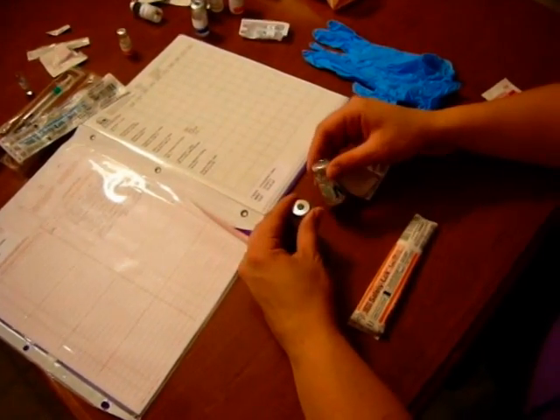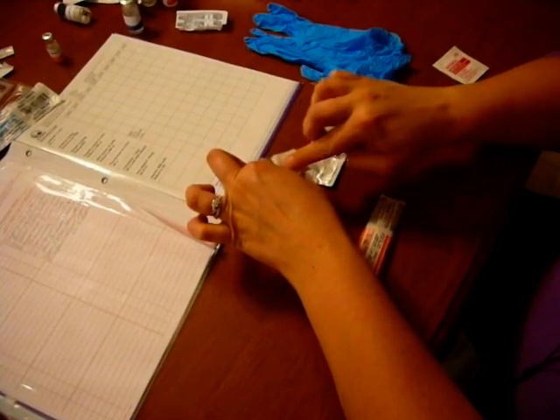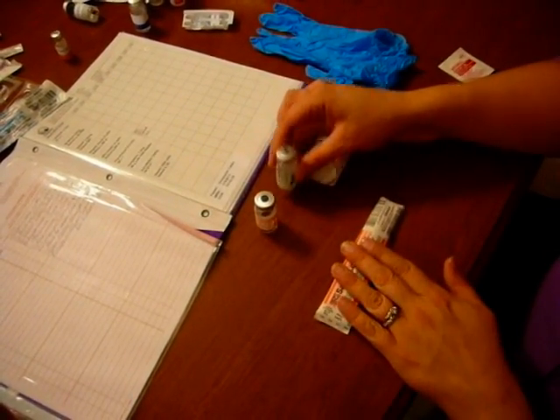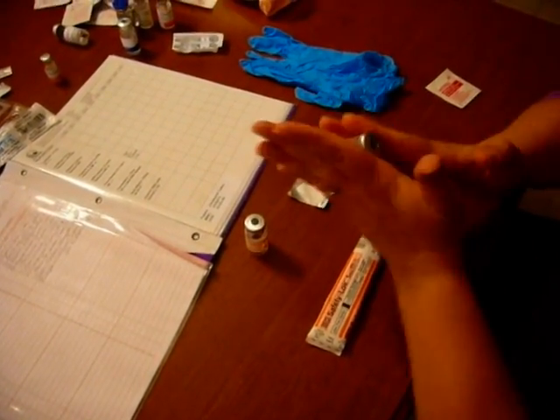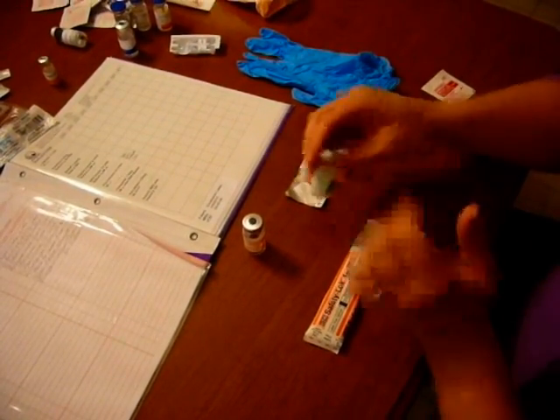I have my regular and my NPH. I have my alcohol wipe and I'm going to scrub the top of both for 3 to 5 seconds. Before I open my syringe, I need to make sure that my NPH, which is cloudy and has precipitate in it, is well mixed, so I'm going to roll it between my hands. We never shake it because we don't want to get air bubbles in there, so I roll it like this to make sure it's ready.